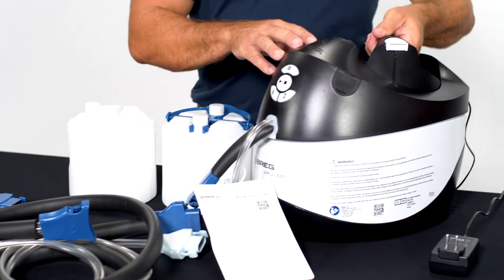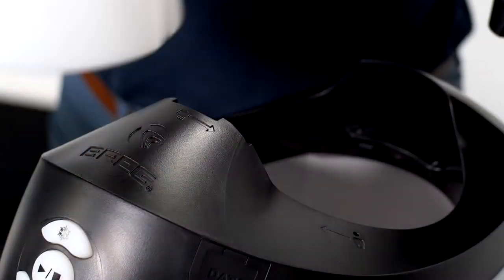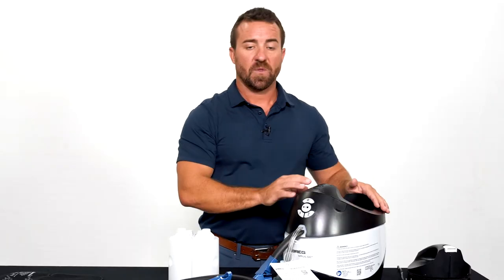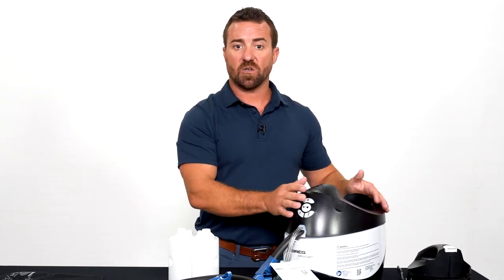To begin, simply twist the top off the machine. Fill water to the water line inside the machine, then place one set of frozen canisters inside. If you do not feel that the cold pad is cold enough, you can add ice to the machine to make it colder.